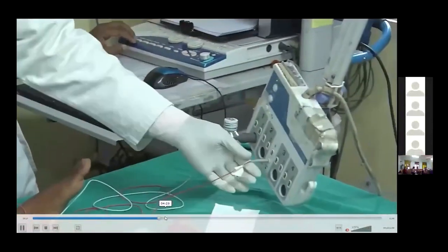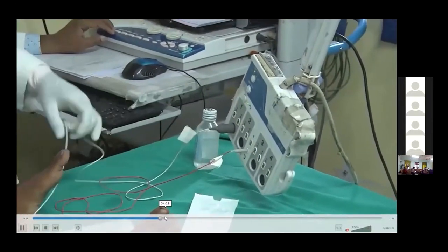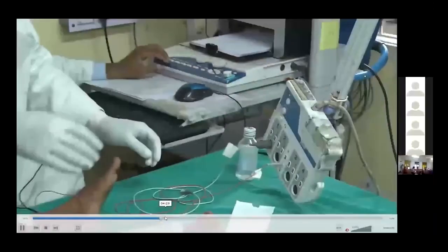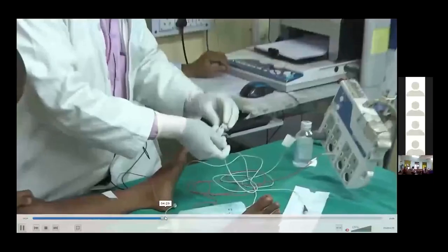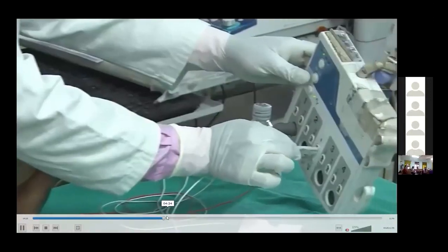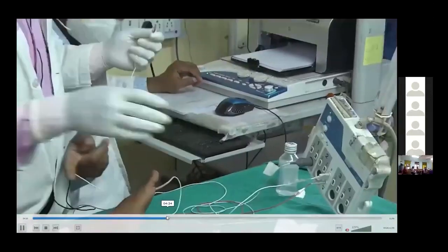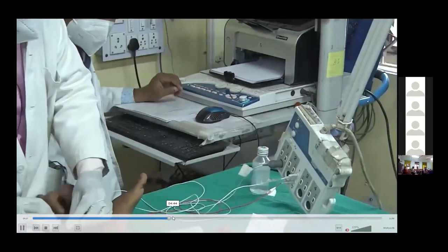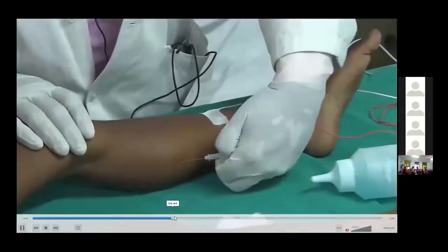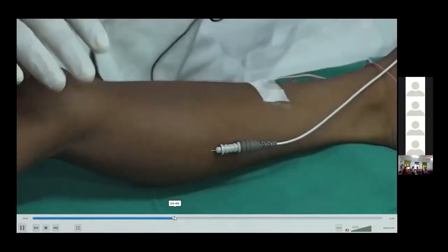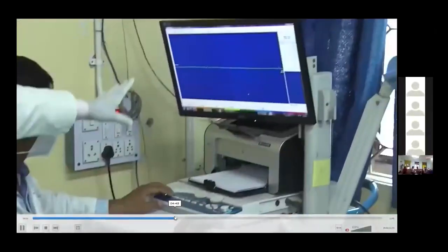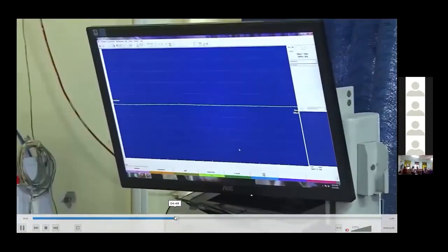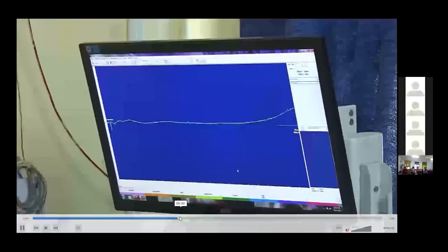Because the video sound is not audible. First, when we insert, we have to see the insertional activity. When it stabilizes, we will look for the spontaneous activity. When the needle is inserted, at that point, we look for the insertional activity. It's normal insertional activity.